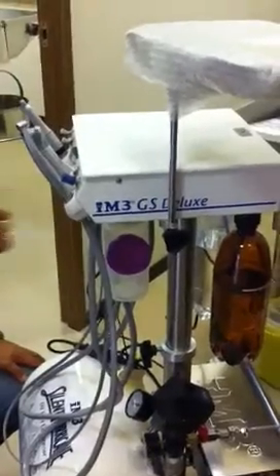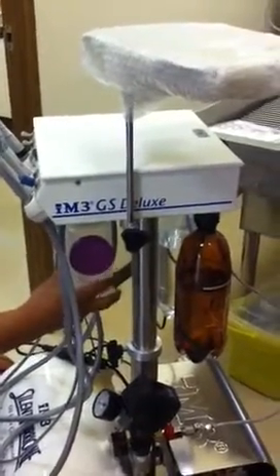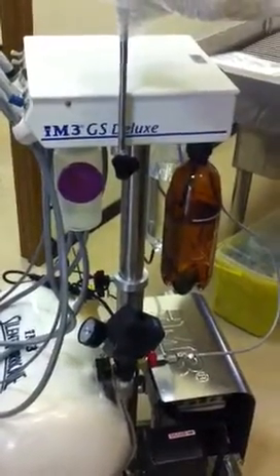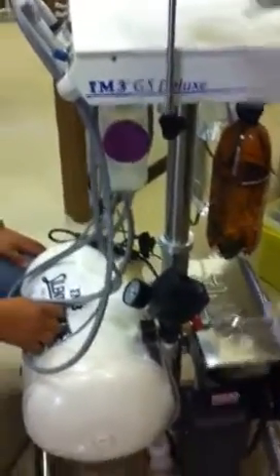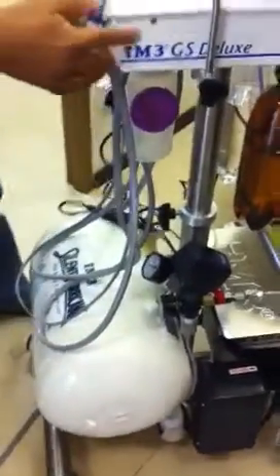It's the blowback of lubricant into this container here. Not to worry, although this is a consumable, in the lifetime of an instrument you'll never get to fill this. Machines that have been used for 10 years still don't need it replaced yet. So this would be the basic operational stuff.